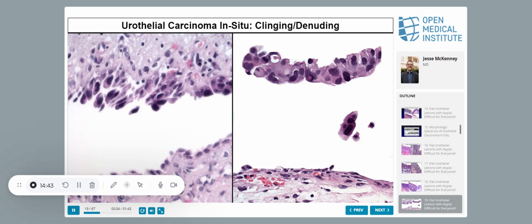I'll have a slide on this, so I'm going to repeat myself, but I'm going to say it since I'm here. If you get a biopsy that looks like this, we sign these out this way. Usually for every urothelial biopsy I start off with "benign urothelial mucosa with." And the reason is, if the urologist wants to turn their brain off after they read those 3 words, that's fine. Because if you start with von Brunn's nests or cystitis glandularis, you're going to get someone in trouble.